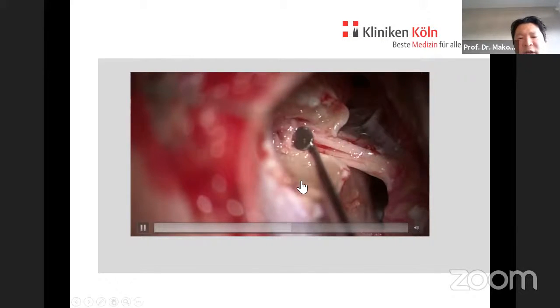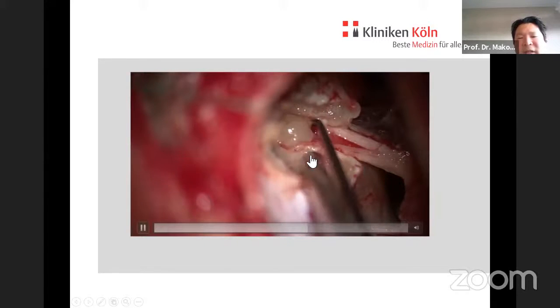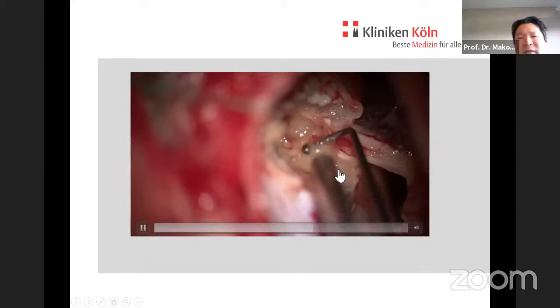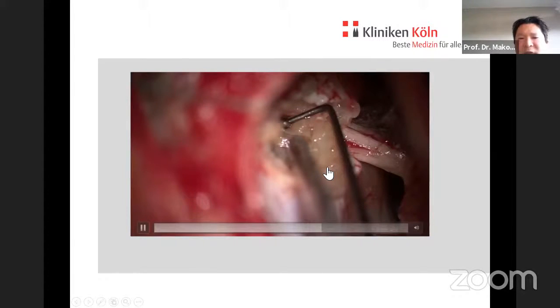So these are the stripes of the dura. Professor Tatagiban in Tübingen calls it the Tübingen line. Because over this line, you can easily drill without having anything except any high jugular bulb, which you need to see in the CT.